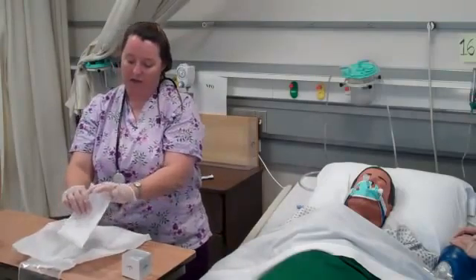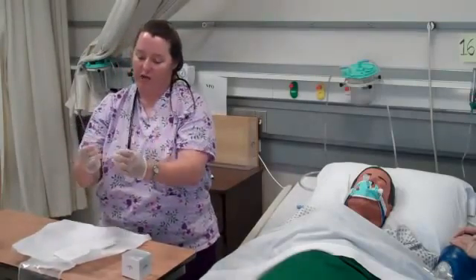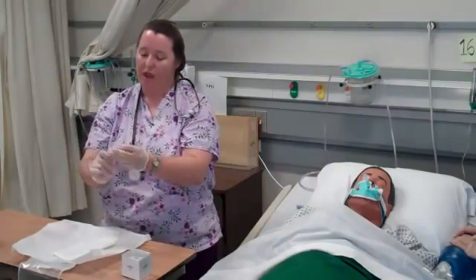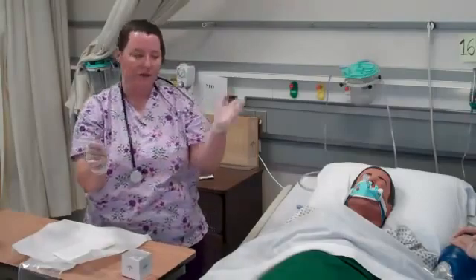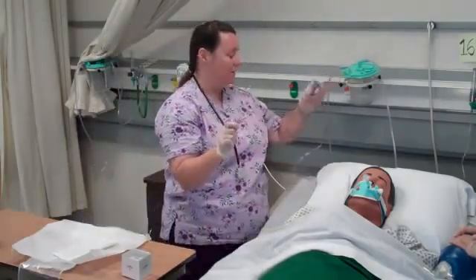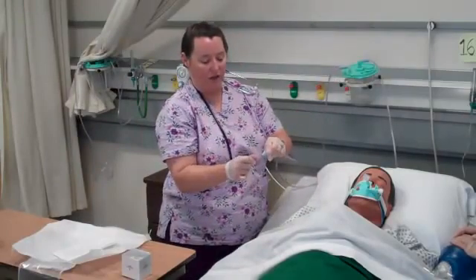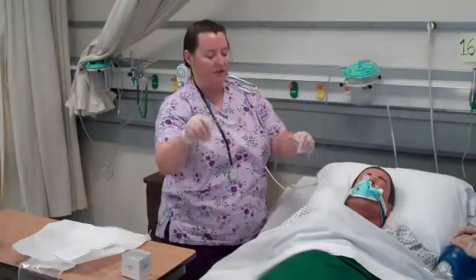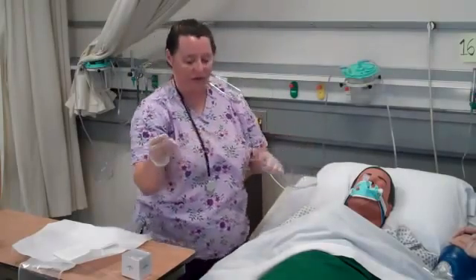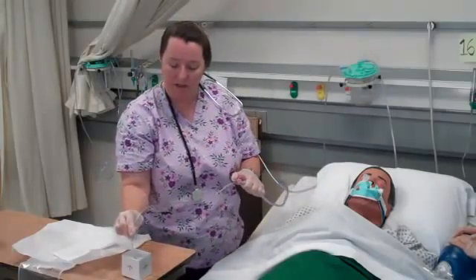I'm going to touch the sterile catheter and loosely gather it around my hand for flexibility. This hand is now sterile; the other hand will be clean only. I'll take the catheter and attach it to the vacuum source, connecting the two connectors together. My dominant hand remains sterile while my non-dominant hand is clean. I'll test the vacuum source to confirm it's working appropriately.